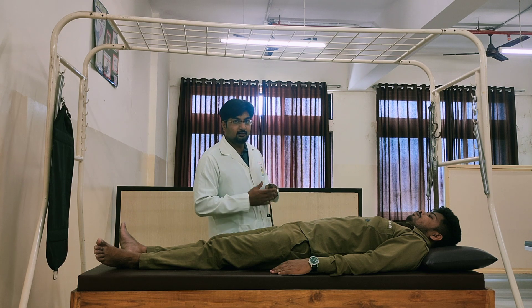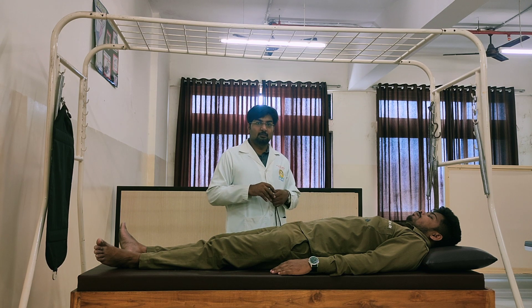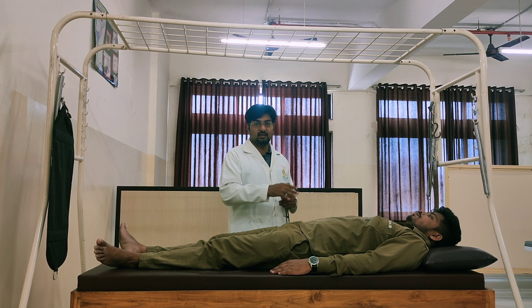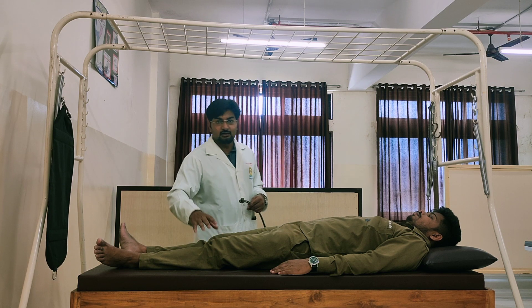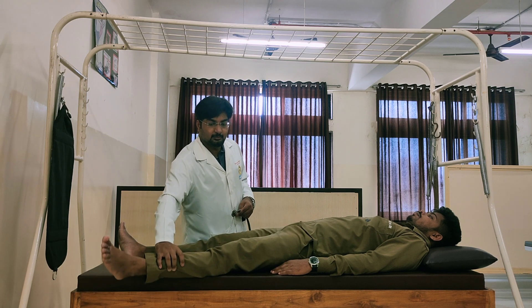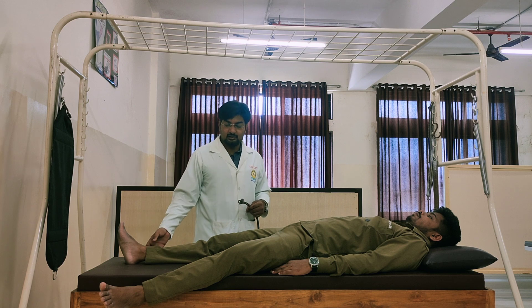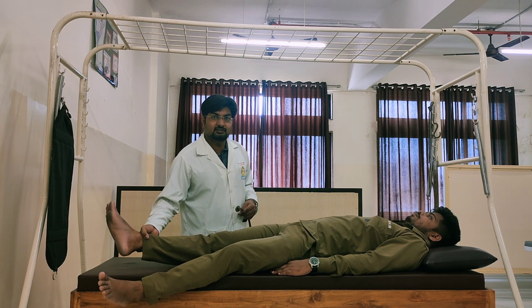Suspension for hip joint — I will now demonstrate abduction and adduction. The position of the patient should be in supine position. The contralateral leg should be abducted and can be supported, and the foot should be supported on the stool, so that there is no restriction while performing the exercise.